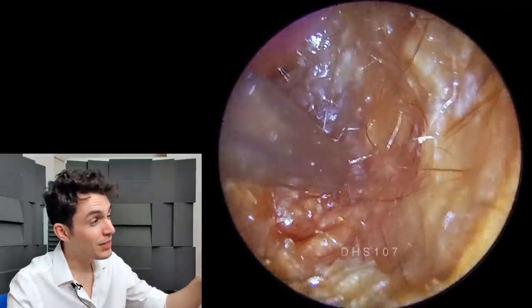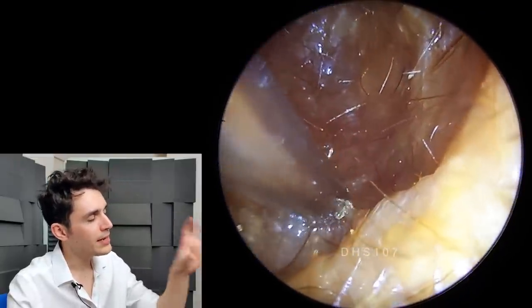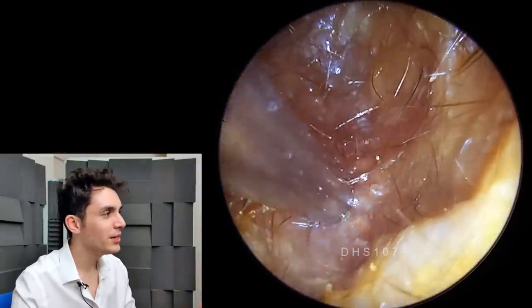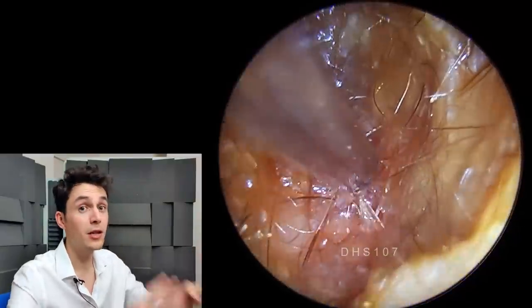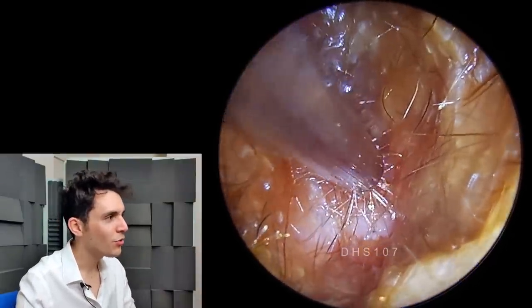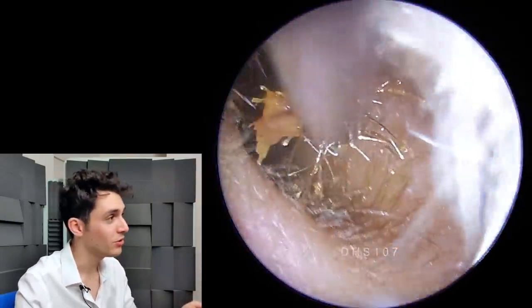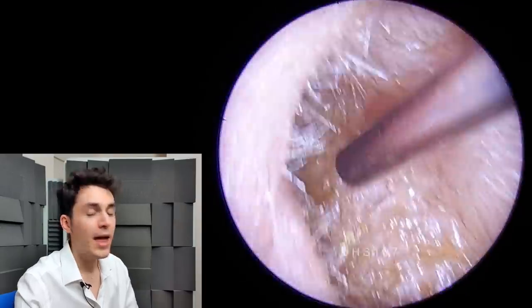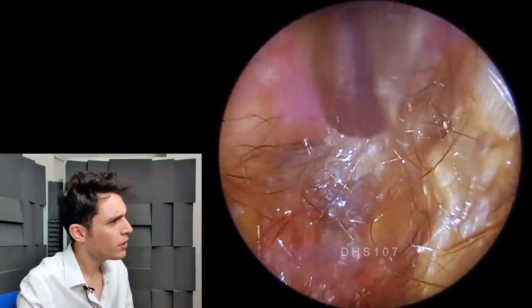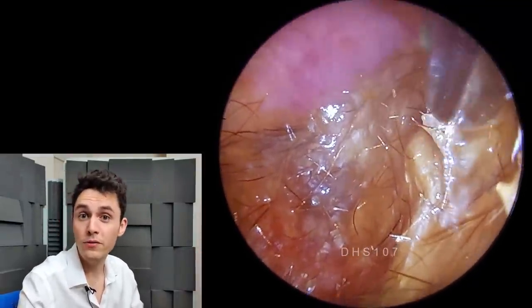The eardrum is, I believe, just on the other side of that deeper slime there. What makes this very difficult is that, for the most part, I'm kind of shooting in the dark here, because the canal is totally coated. I'm not entirely sure where I can press, where I can apply pressure, or where I can navigate with the suction tube. The hair is also creating a very difficult matrix.